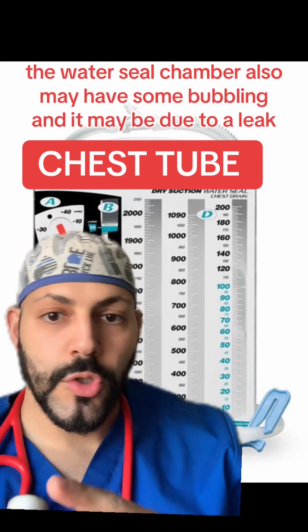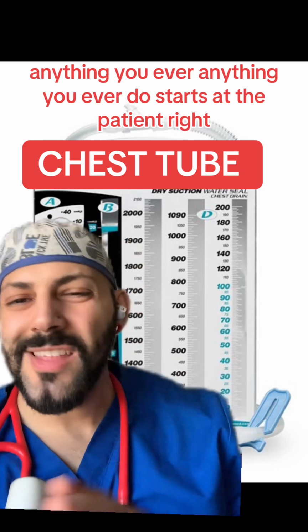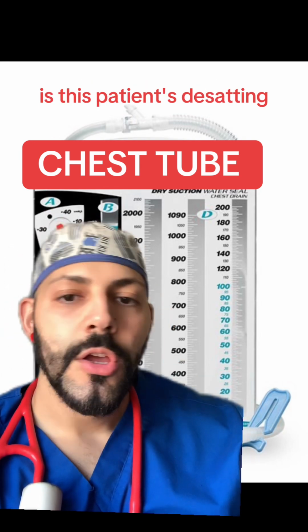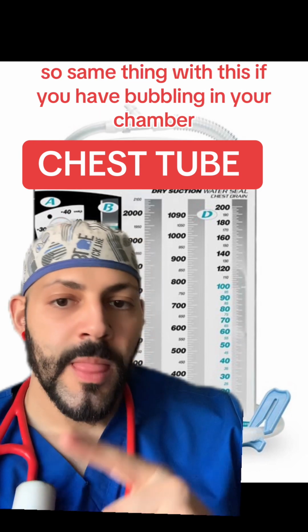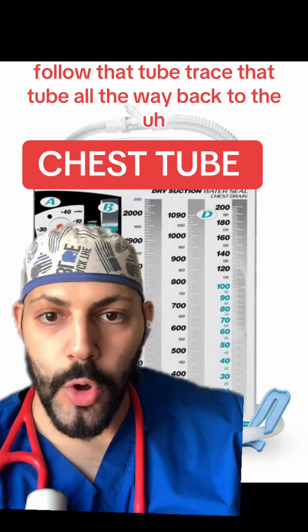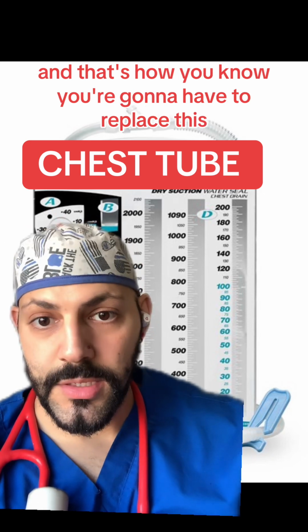The water seal chamber also may have some bubbling, and it may be due to a leak. And what you're going to do is you're going to start at your patient. Anything you ever do starts at the patient, right? If your vent is beeping, if there's oxygen, the patient's desatting, you always start with the patient, okay? So same thing with this. If you have bubbling in your chamber, you're going to start where your patient's incision is, where the chest tube is coming out, and work your way outwards. Follow that tube, trace that tube all the way back to the chest tube system itself, and try to find where that leak is, okay? And that's how you know you're gonna have to replace this.